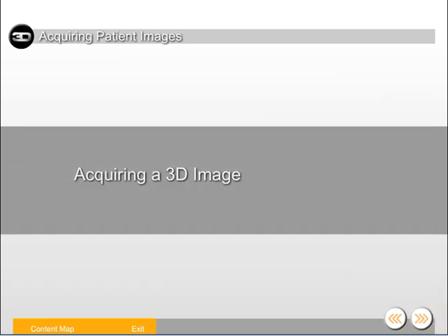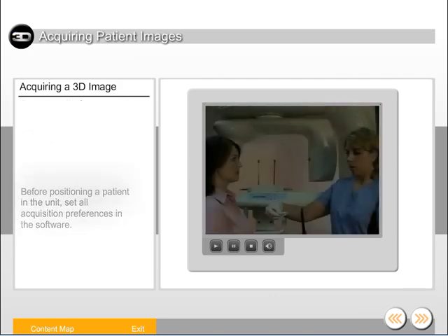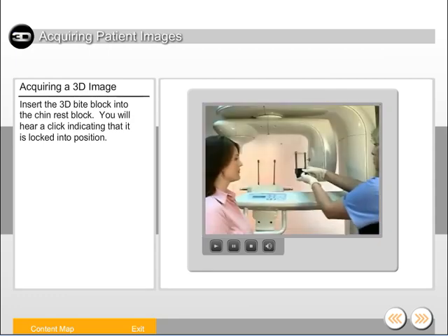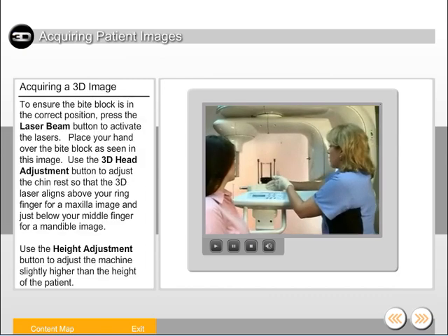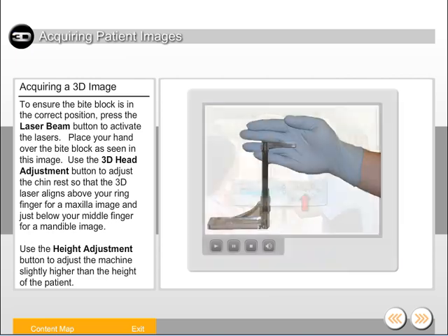Let's take a look at positioning a patient to acquire a 3D image. Before positioning a patient in the unit, set all acquisition preferences in the software. Insert the 3D bite block into the chin rest block — you will hear a click indicating that it is locked into position. To ensure the bite block is in the correct position, press the laser beam button to activate the lasers. Place your hand over the bite block as seen in this image. Use the 3D head adjustment button to adjust the chin rest so that the 3D laser aligns above your ring finger for a maxilla image and just below your middle finger for a mandible image.